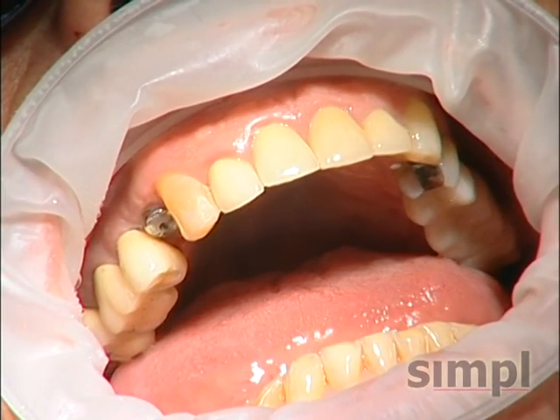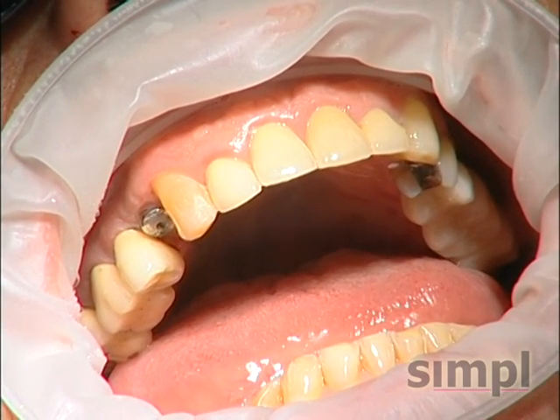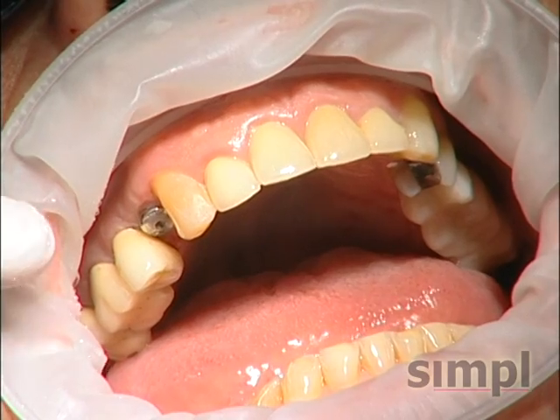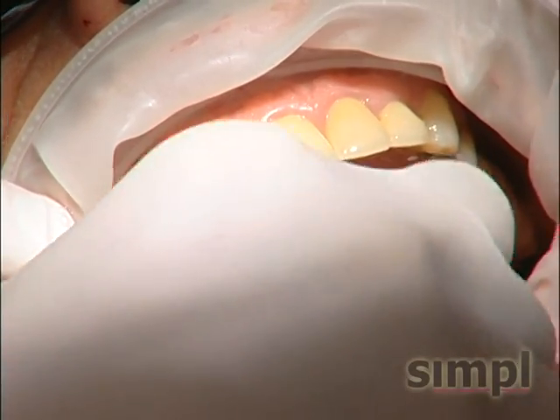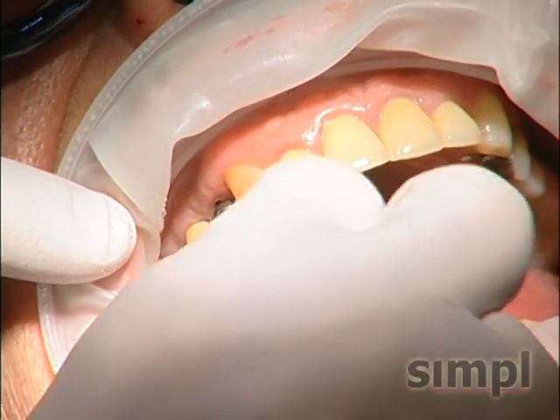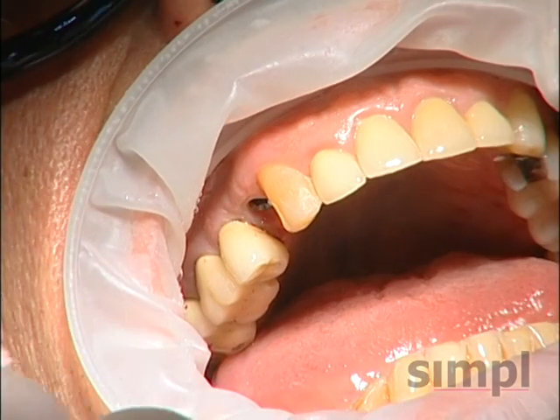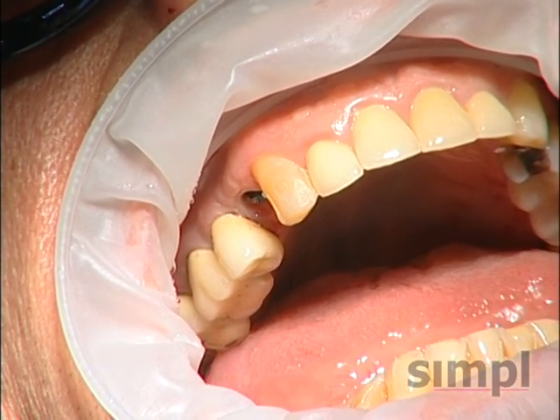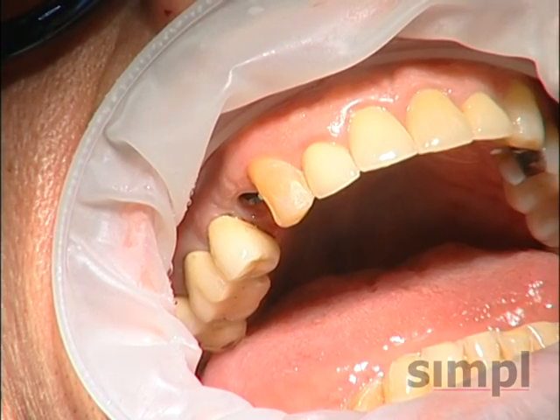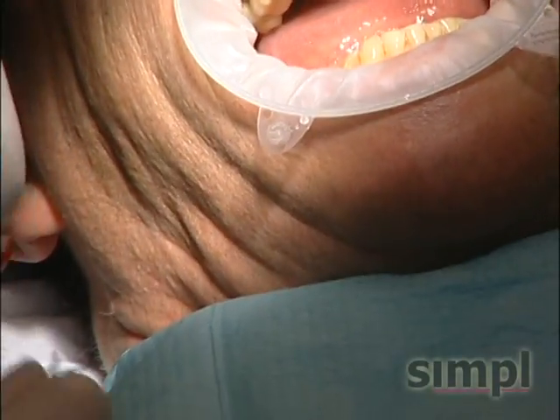This is the second appointment for our simple restoration. Laboratory has done their work. We are ready to proceed. We're going to remove the tissue healing cap. We are now going to use the Atlantis fixture with the Duralay jig to help seat it properly.